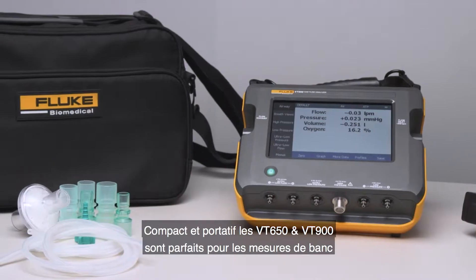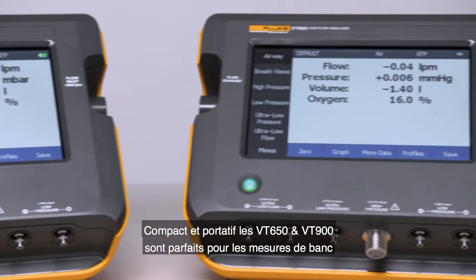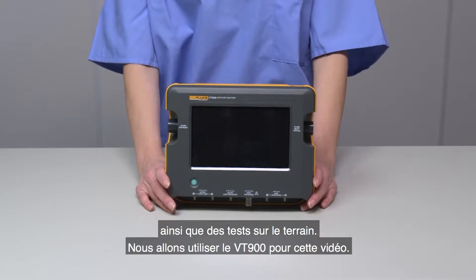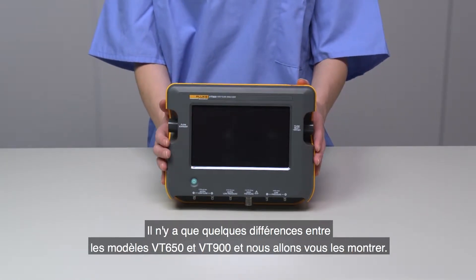Compact and portable, the VT650 and VT900 are perfect for both benchtop testing as well as on-the-go testing in the field. We're going to use the VT900 for this video. There are only a few differences between the models, and we'll point them out as we go.